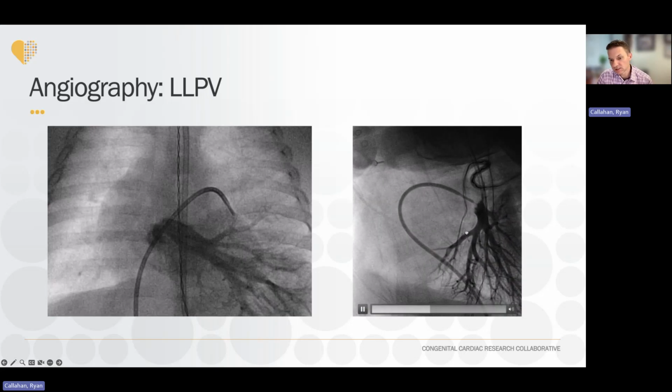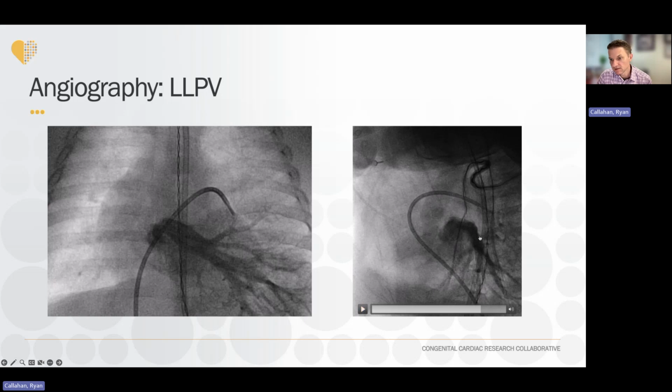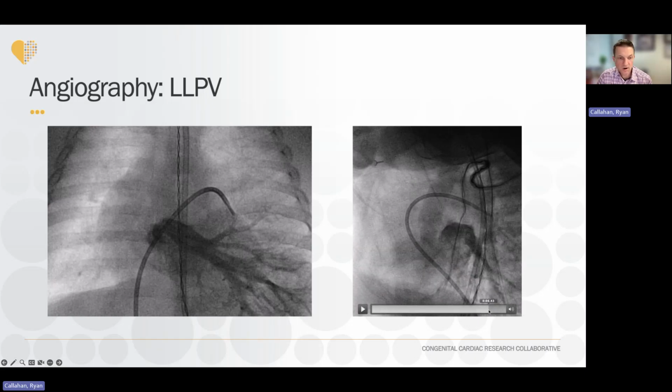And then this is the lateral projection, and it's common for us to see that there's some anterior-posterior narrowing here as the lower vein courses between the aorta and the heart. But as long as it remains tall in the superior inferior dimension, then that's going to be okay with no disease. So this one's normal.